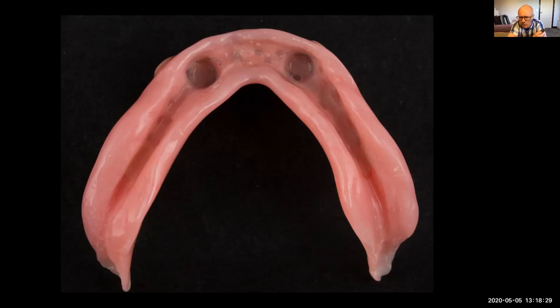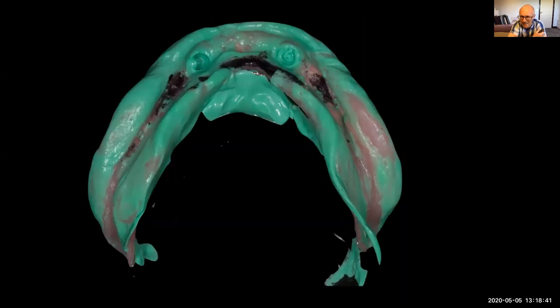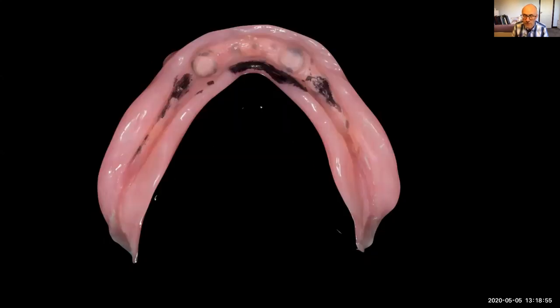I put silicone impression material, a light-bodied wash, it's a fit check, on the fitting surface. Take that to the mouth, press it down firmly, wait for it to set, take it out, and where it pushes through, so you can see I've marked it with a Sharpie here, I mark it, peel off that silicone, and then adjust that with a tungsten carbide burr, and then take that back to the mouth and make sure it's totally comfortable. So I want to just check that. I want to make sure the occlusion's right, and then off Lynn goes.